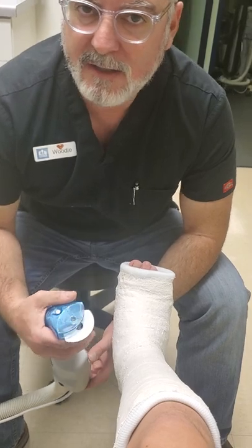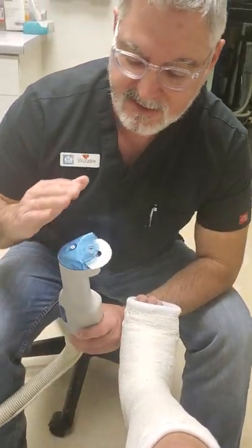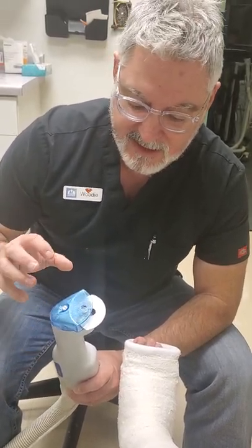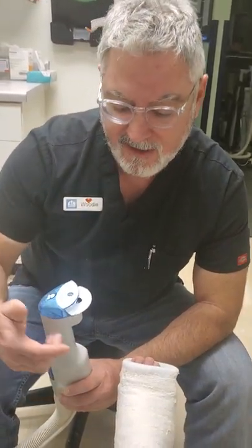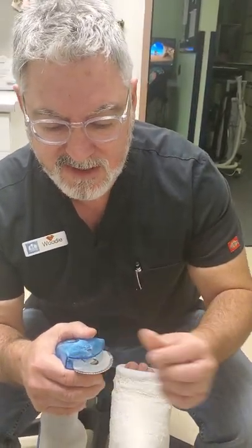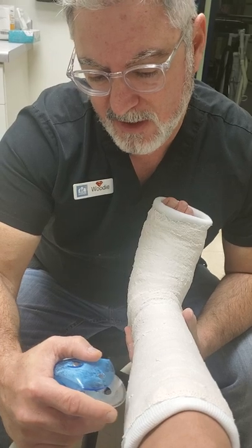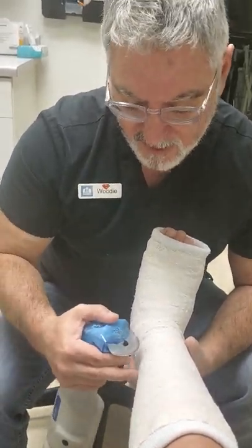I will not be talking while removing the cast, because the cast saw and the cast vac working together in unison are a bit loud. I'll go ahead and remove it and then talk after. Just remember, I'm going to be using the in-and-out method — as I'm penetrating the plaster I'll be going in and out each time, so as not to penetrate through the cotton. Here we go.